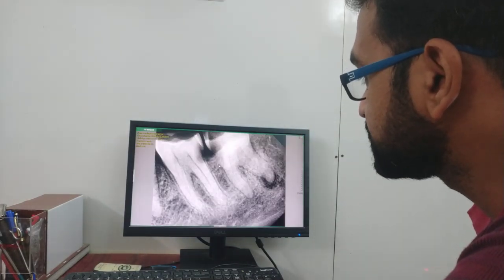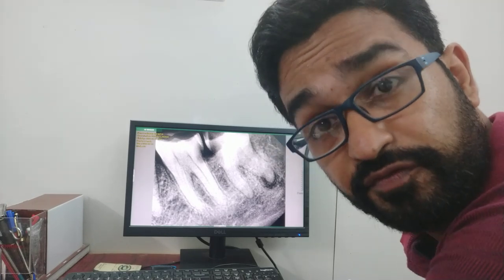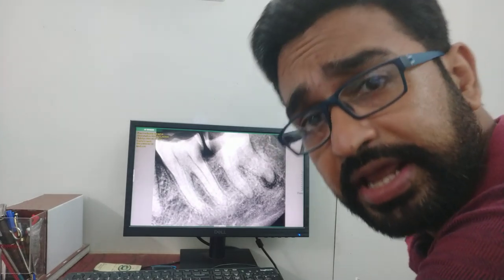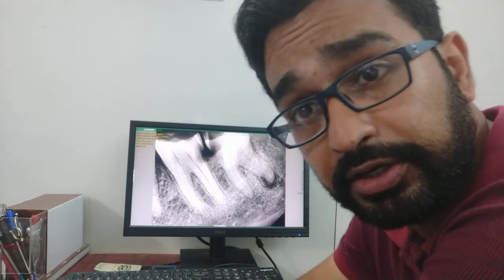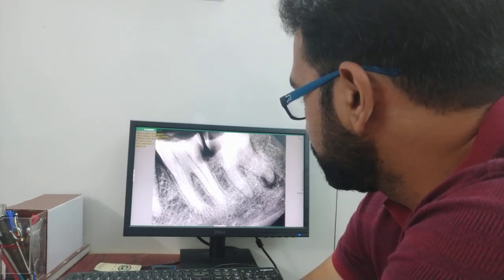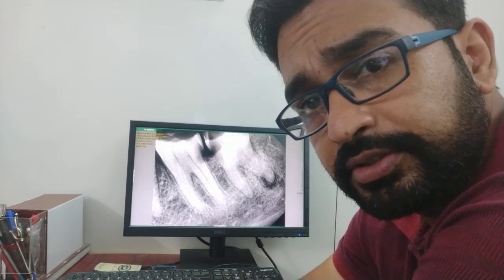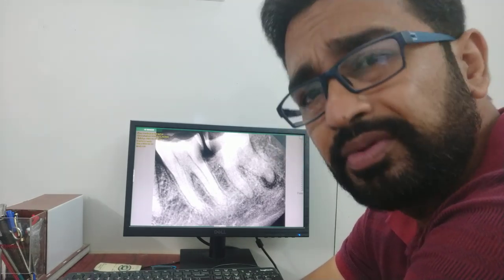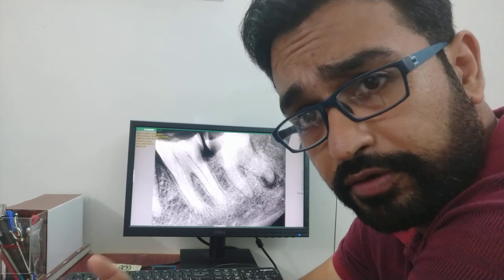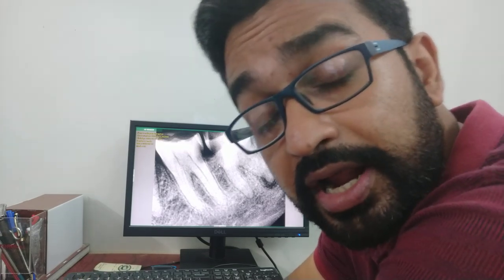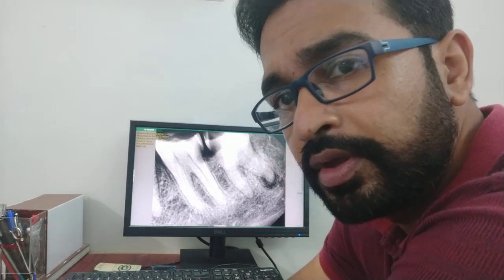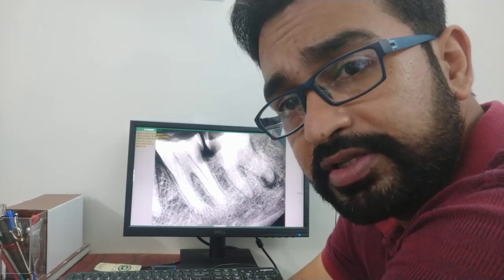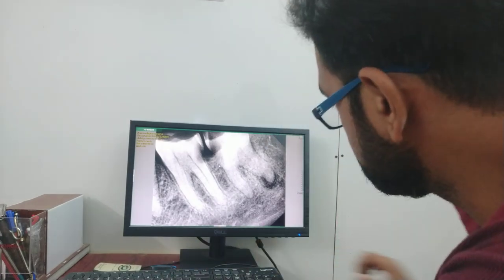I chose this case because the patient came with severe pain in the 38 region — the left lower back tooth region. When she came to my clinic, she was around 65 years of age and had only hypertension. What is important here is the periapical lesion you can see here.